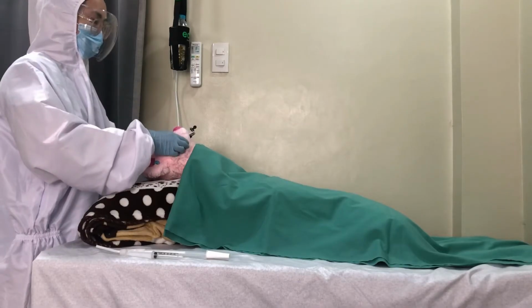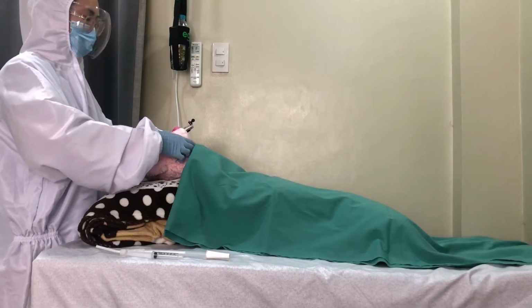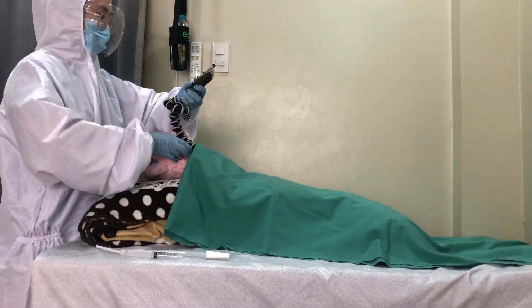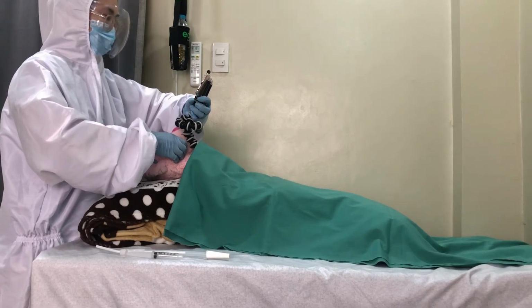We can now proceed with the endotracheal intubation. Open the mouth with the right hand and the laryngoscope is held with the left hand and is inserted on the right side of the mouth, pushing the tongue to the left and upwards. The laryngoscope is advanced until the tip of the epiglottis can be seen posterior to the back of the tongue.